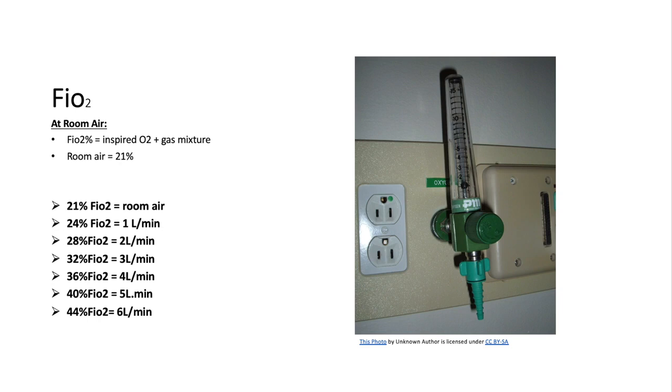Let's take the time and go over the FiO2 delivered. FiO2 is the fraction of inspired oxygen and gas mixture at room air, which is delivered as a percentage that equates to 21% that a patient inhales without supplemental oxygen. So your FiO2 is delivered as a percentage of concentration of oxygen that a person inhales.